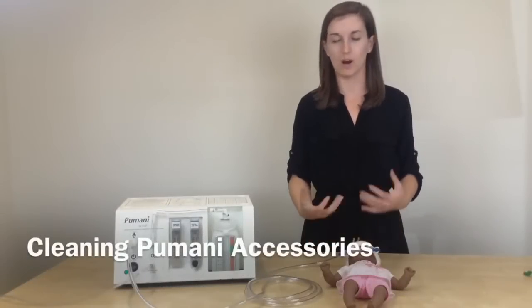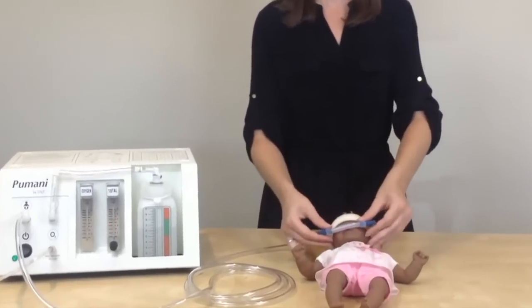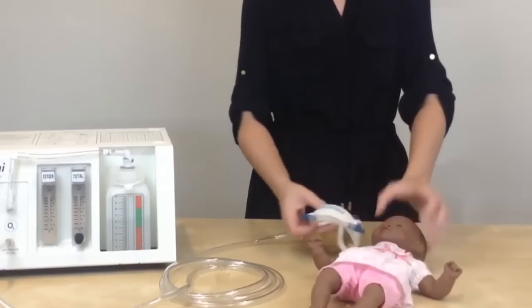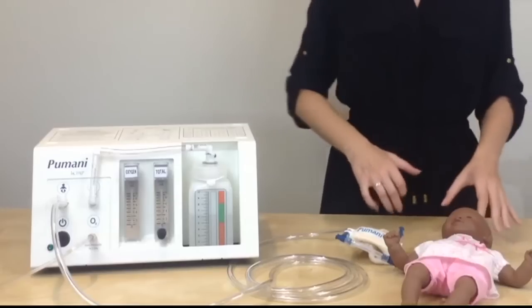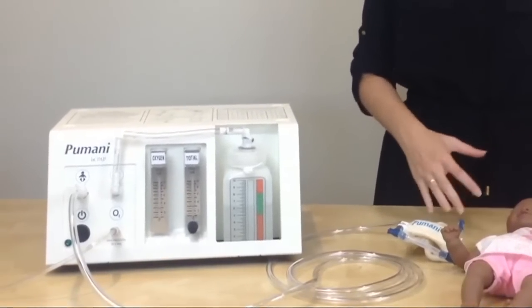When your patient is ready to come off of Pumani treatment, you will first remove the prongs from the patient's nostrils, and you can completely remove the hat. Then you will turn off the unit. If the patient still needs respiratory support, you can place them on oxygen therapy or just regular room air.